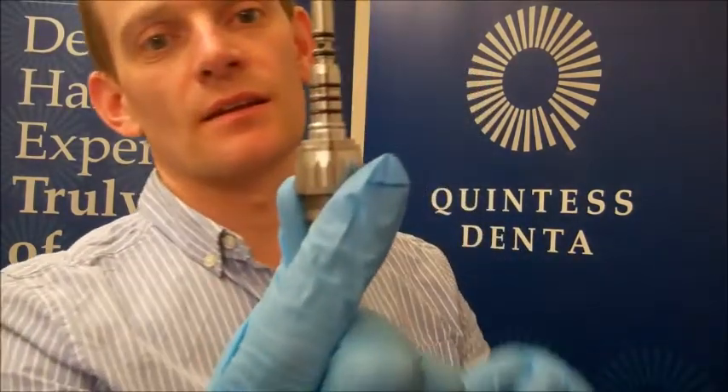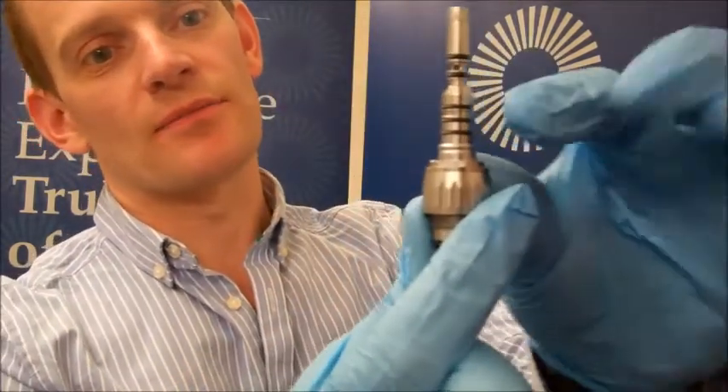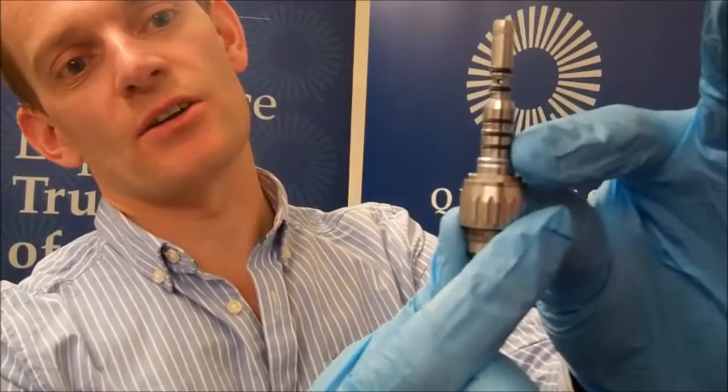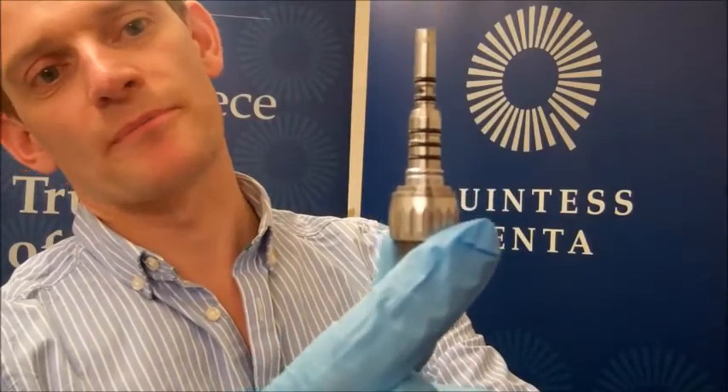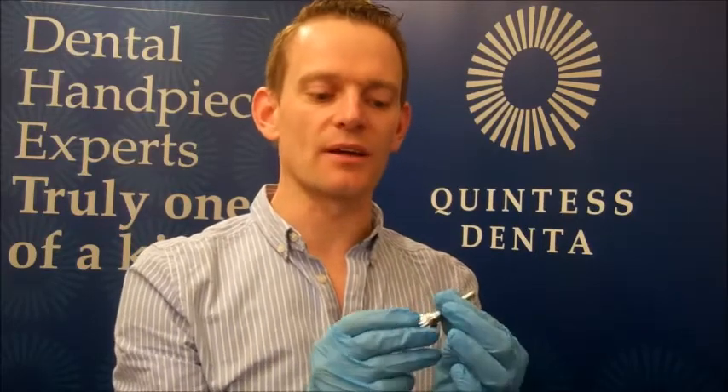Today I was asked by a customer: is it a big job to change the O-rings on a coupling? Here you can see we have three large O-rings at the bottom and two slightly smaller ones at the top. These should be changed periodically, roughly every six months, because as they become frayed and worn you start to get air and water leaks. So if you're finding a leak at the coupling at the base of the handpiece when it's connected, there's a good chance the O-rings will need replaced.